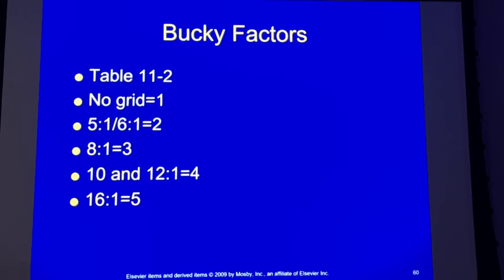So what if you don't adjust your technique? You expose using 80 kVp at 10 mAs and then you introduce a grid. What are you going to see? It's going to be too light, right? Or your index number is going to indicate that you underexposed by a factor of 3. Okay, so if you go from a 3 to a 5 and you don't make that adjustment, what's going to happen?